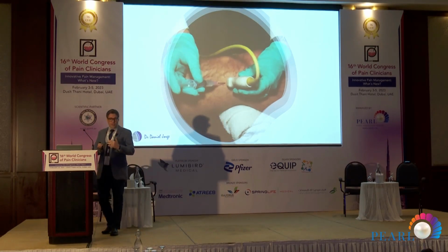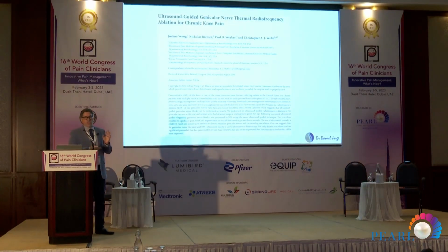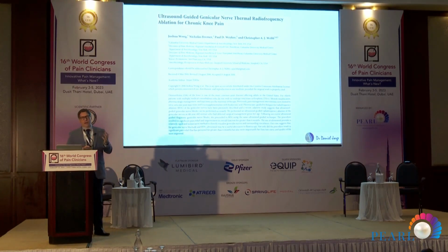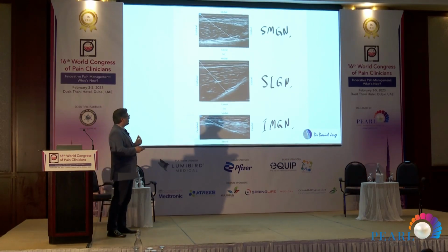You have to pay attention to both hands and the screen to be aware of the direction your needle is going. This paper shows exactly how to use the ultrasound to guide these procedures at the knee. It's for the thermal radiofrequency, but it's the same point. You can adapt it for the pulse radiofrequency as well.